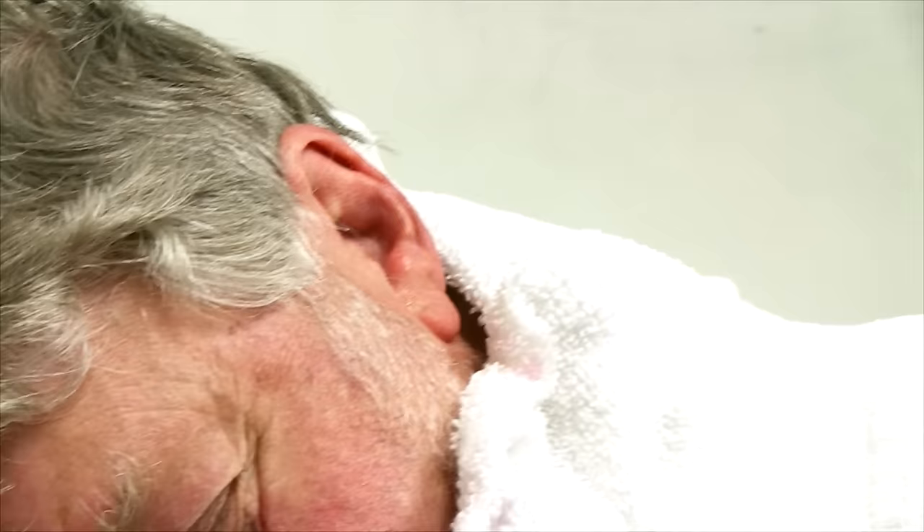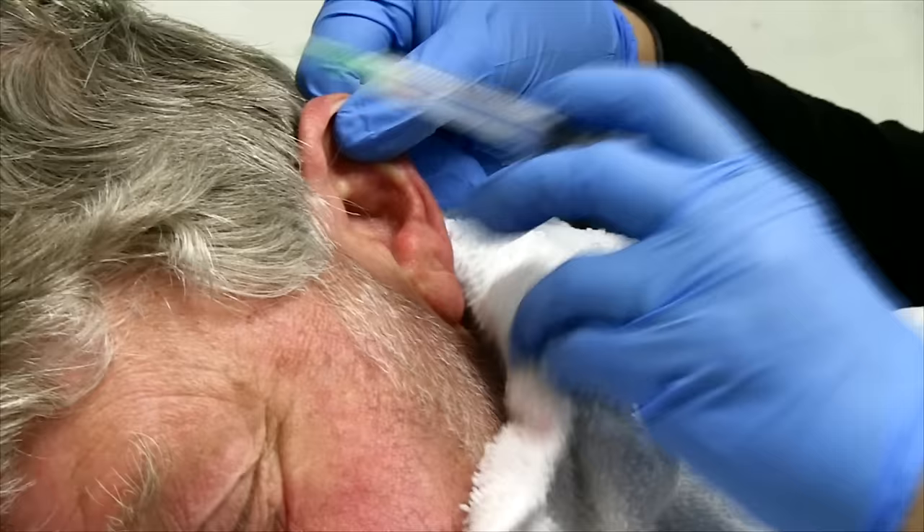And oftentimes patients will tell you — they can tell when it's starting to really come, because they can start to hear.